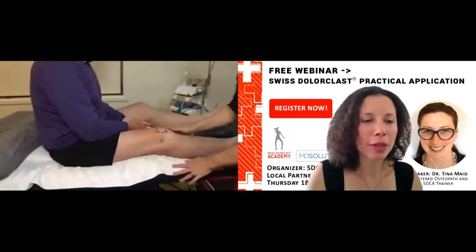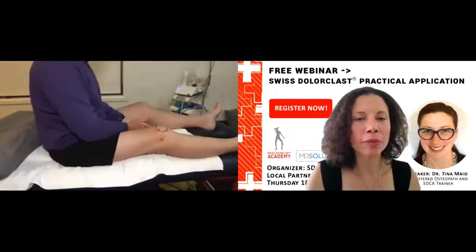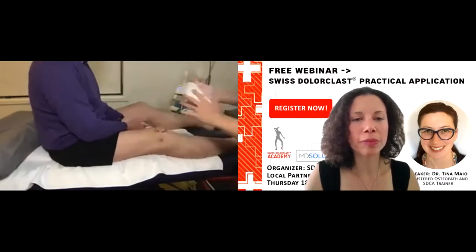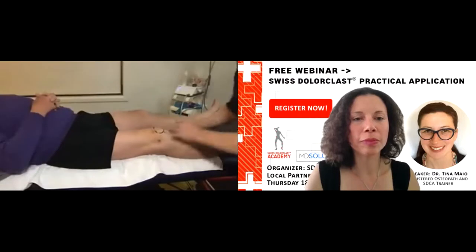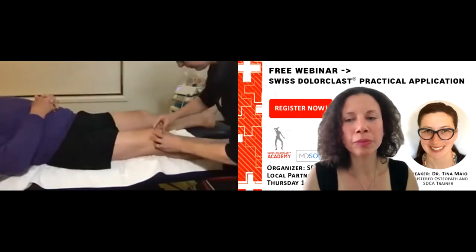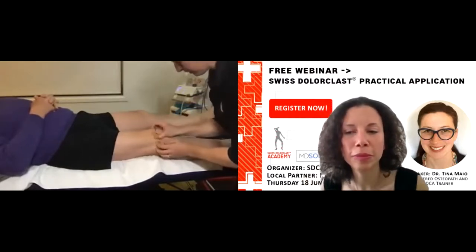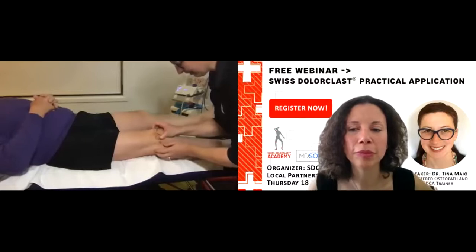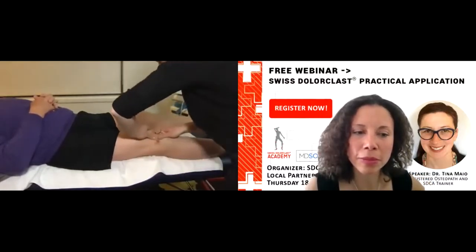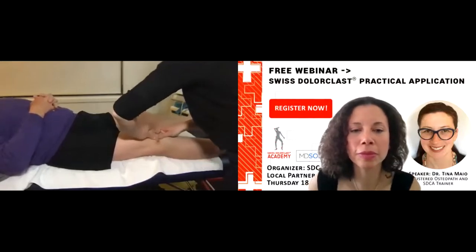Okay, so the first thing I'm interested in, I want to see, have we got a little bit more play in that patella? So can you lie down for me, Mum? Yeah. So I'm just going to see if I can wiggle it around a little bit. There's a little bit more movement there, which is good. So you can be pretty aggressive and try, just encourage. Can you feel that? Oh, I can feel it.